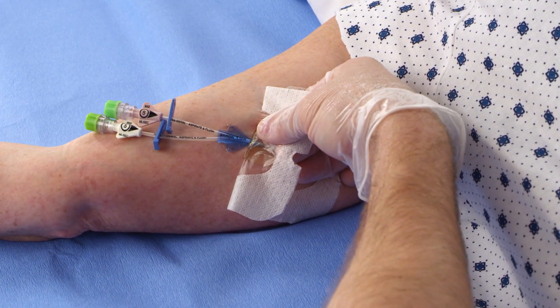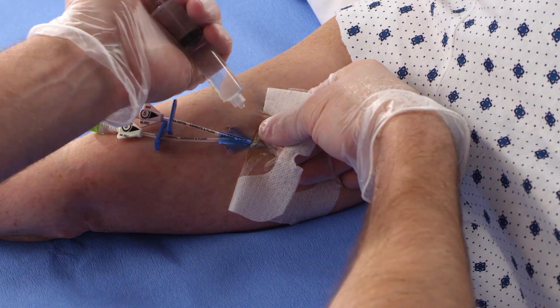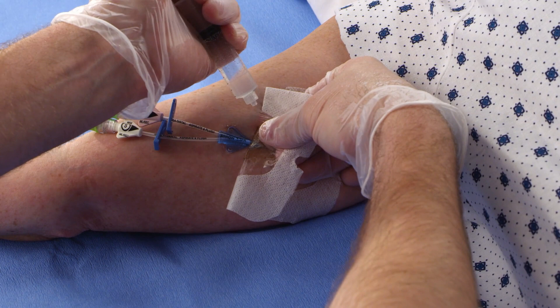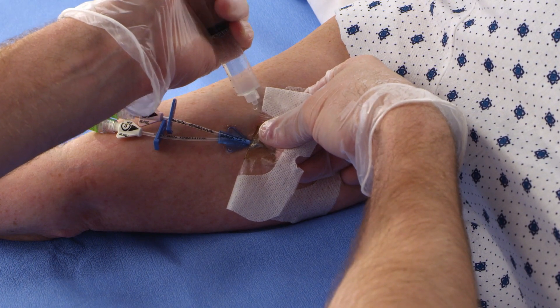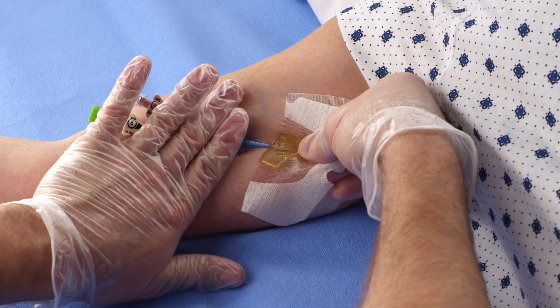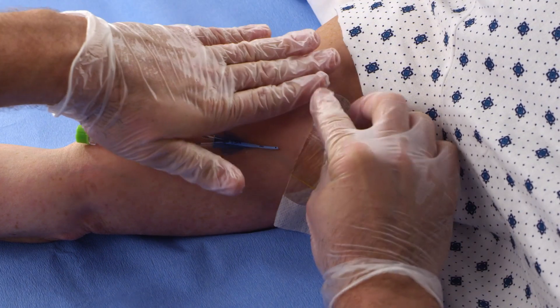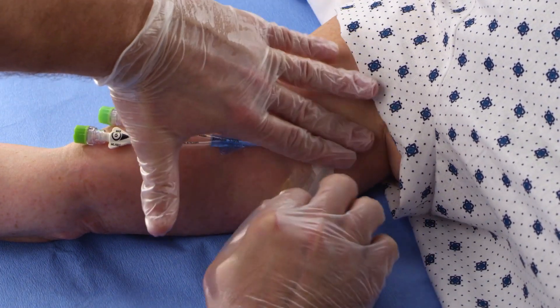To facilitate removal, apply moisture to the gel pad, making it temporarily slippery. Using an alcohol swab, sterile saline, sterile water, or an alcohol-based skin antiseptic, apply the moisture to the gel pad at removal in a back and forth manner while peeling the dressing off the skin. Then continue the low and slow removal method until the dressing is completely removed.